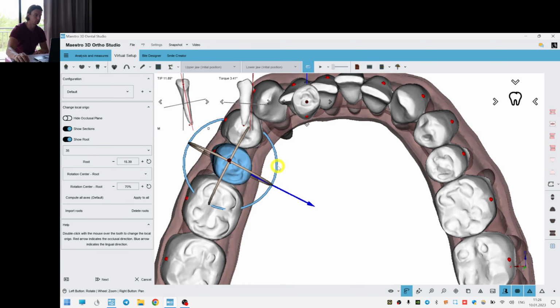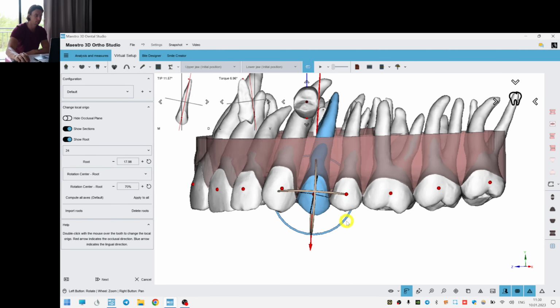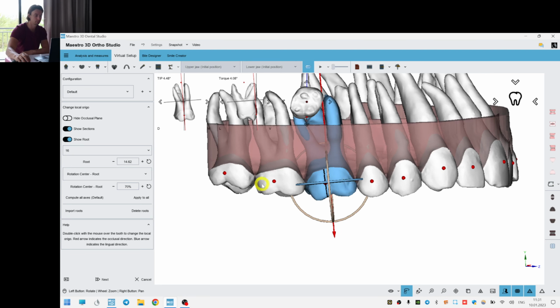Well, now let's go to the side view. So here we are ignoring the anatomy because we're just going to expand, nothing else. Wow, so big roots. It's gonna be a hard case. It might look simple because it's just a regular crowding, but we have to be very accurate with the roots of this size. We'll reduce all the movements down to some very minor numbers.